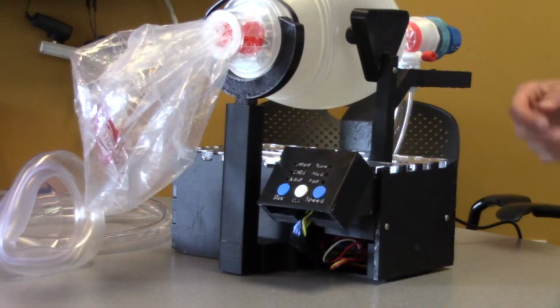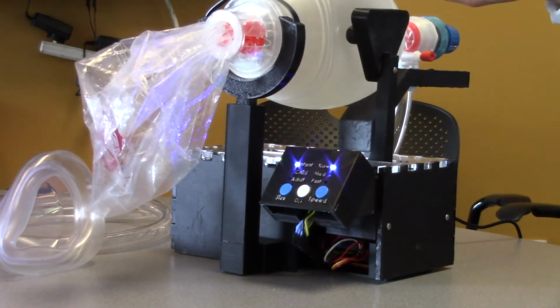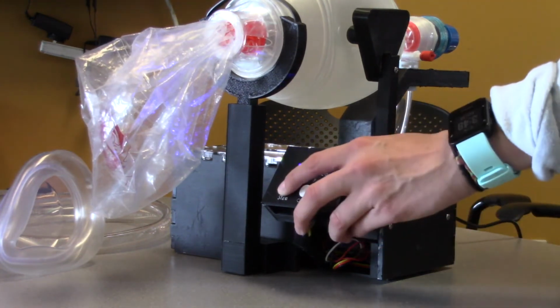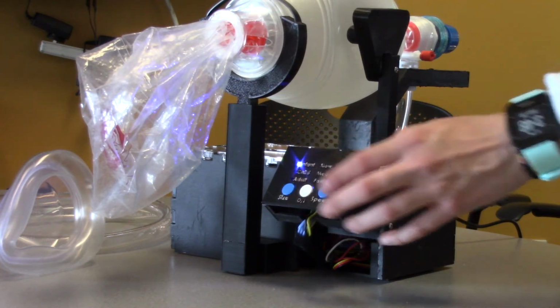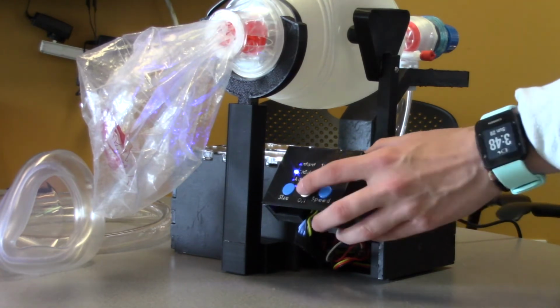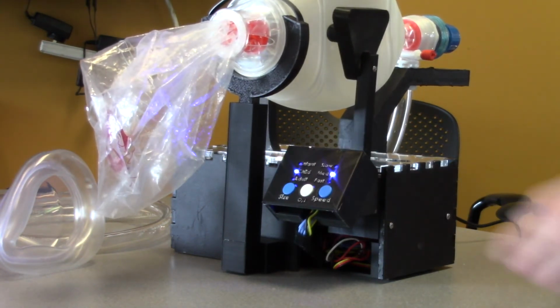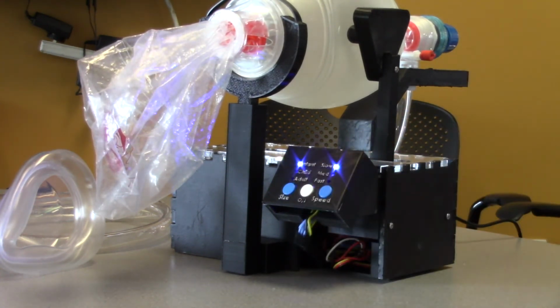In order to initiate the compression stroke, you first turn on the device, and it goes through a calibration sequence in which it closes the bag completely and opens it. That will allow the motor to know the full range of motion. We then use the user interface to select the different settings between infant, child, adult, and slow, medium, and fast. So if I want to bag a child at medium, then I would go to child, medium, and then press the white button, which will initiate the compression. When I want to stop the compression, I hold the white button and let go. And then I can choose a different setting.